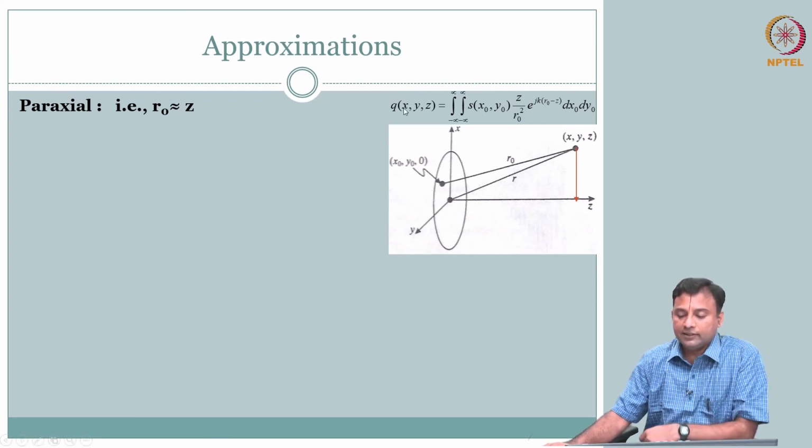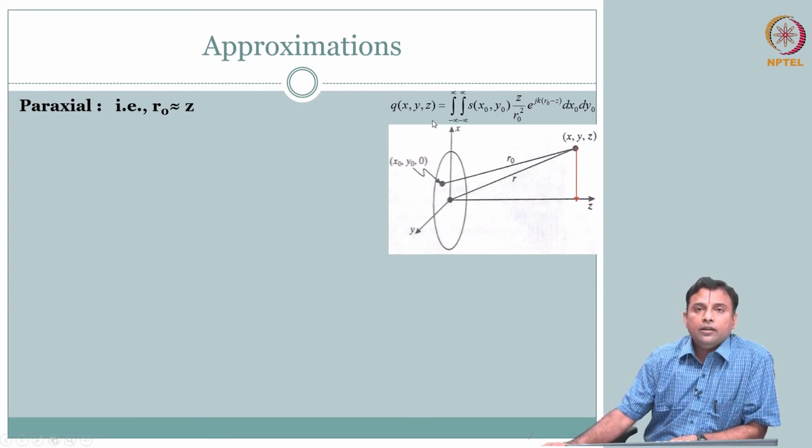So we will take this, this is the main term, your q of xyz. This is in some sense also the directional function that is referred to sometimes, or the field pattern that you really are looking at. So this integral is determining the field pattern, the shape. We will make it a little more straightforward to analyze this.